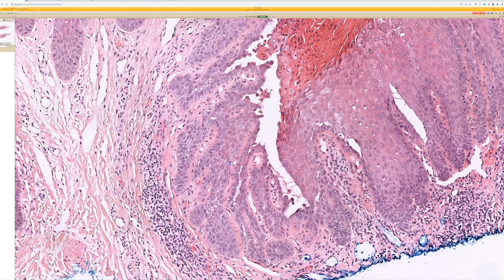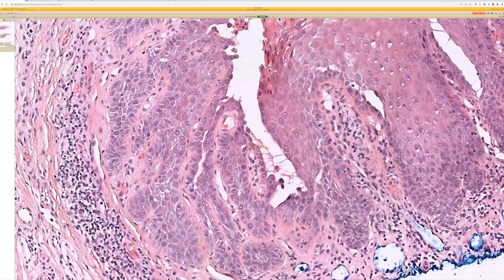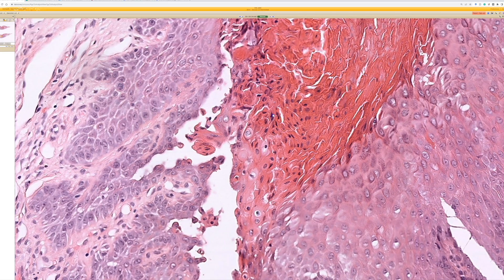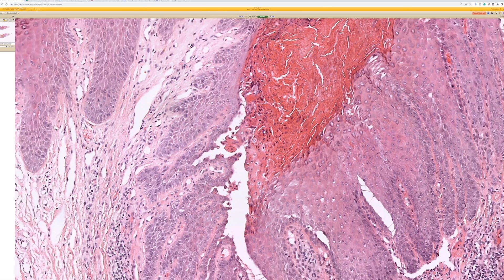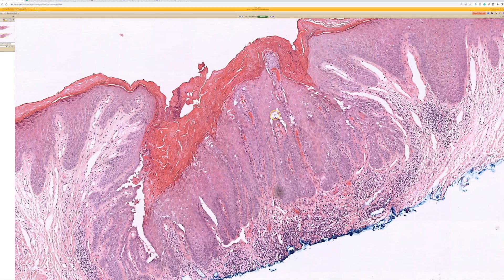When you get a deep enough biopsy, you see multiple little reedy invaginations down into the dermis with acantholysis and rounded dyskeratosis — looks like rounded perikeratosis or corps ronds and grains. This mixture of acantholytic dyskeratosis with a single lesion that invaginates down into the skin, usually on the face, is called a warty dyskeratoma.